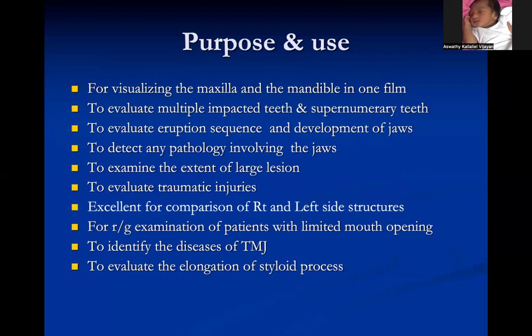Indications of OPG: for visualizing the maxilla and the mandible in one film, to evaluate multiple impacted teeth and supernumerary teeth, to evaluate eruption sequence and development of jaws, to detect any pathology involving the jaws, to examine the extent of a large lesion, to evaluate traumatic injuries, excellent for comparison of right and left side structures, for radiographic examination of patients with limited mouth opening, to identify the diseases of TMJ, and to evaluate the elongation of styloid process.